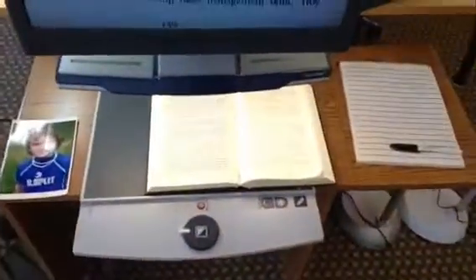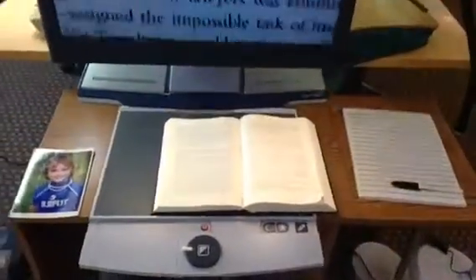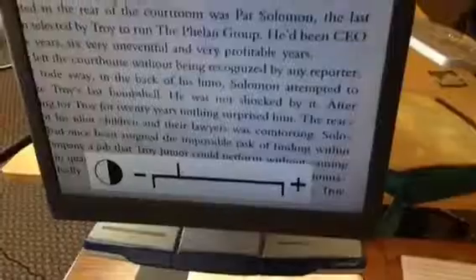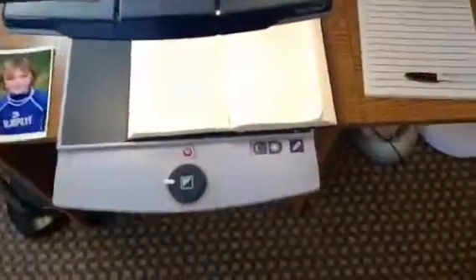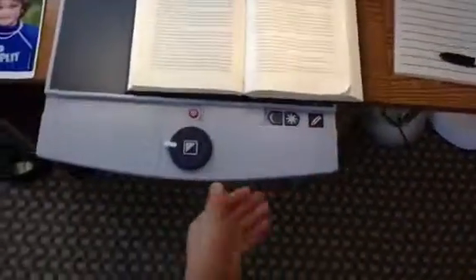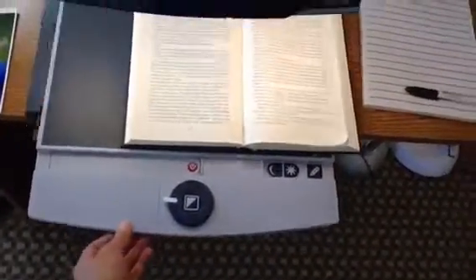Using the dial, we can increase and decrease our magnification up to 65 times. Brightness options to increase and decrease brightness. Autofocus feature. Electronic brake for the XY table.